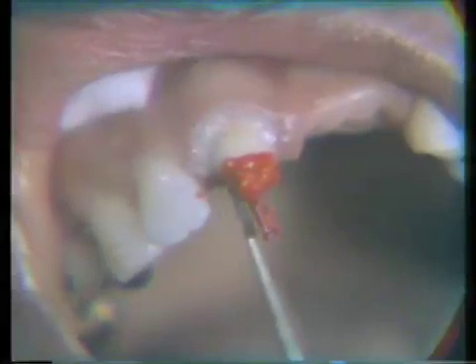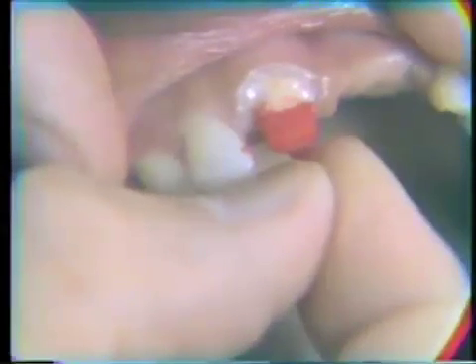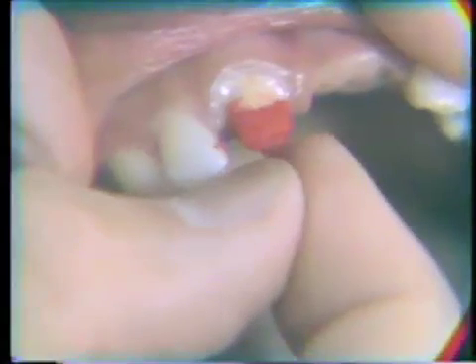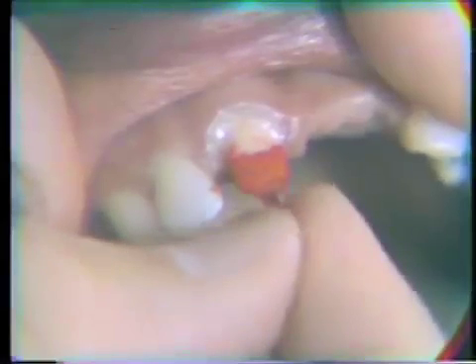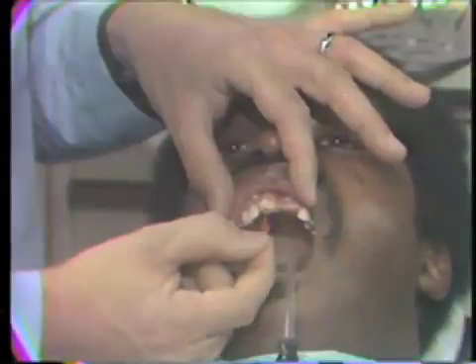We are trying to simulate an ideal preparation for a porcelain-fused-to-gold restoration. This can also be modified with inlay wax. Now as this starts to polymerize, you've got to tease it up and down so it doesn't get locked in the canal itself — just lift it slowly and set it back in again — so that the post is not hardened in an undercut area. While it's still soft you can drag it on and off. We'll remove the post and then re-lubricate the canal, place the Duralay post back in, and tease it up and down until the Duralay has polymerized.